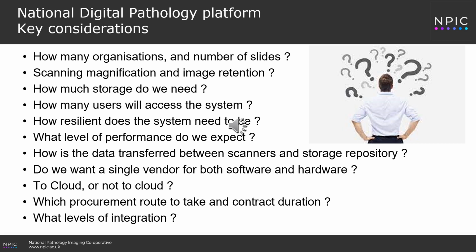What levels of integration? Well, integration is always key to a seamless workflow. Our ambitions are to ensure that the tracking system, LIMS, which is a lab information system, and the PACS system are all integrated. But to be honest, it's easier said than done.